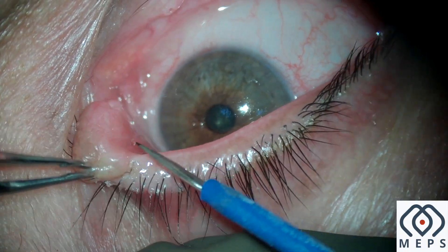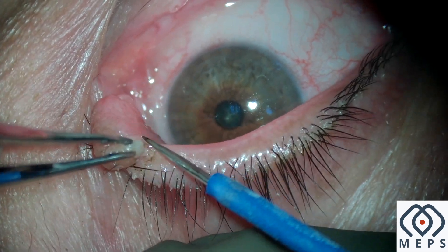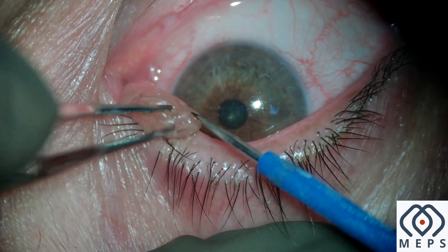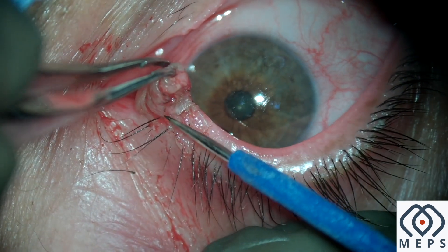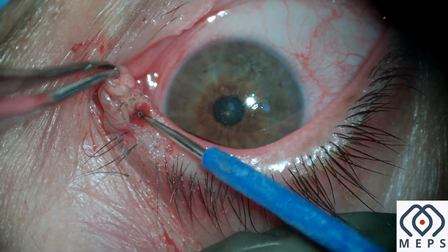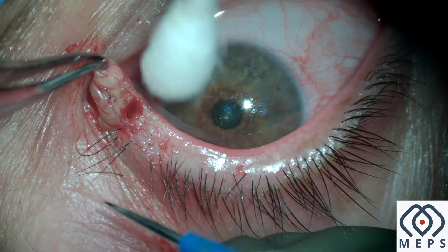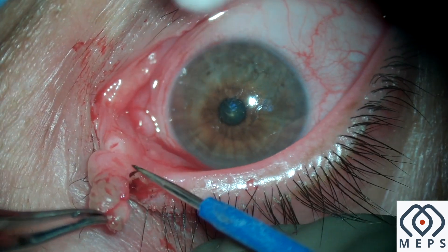Following this, a radio frequency tip is used to start shaving off the base of the lesion. You can see that the base comprises multiple vascular fronds which need to be coagulated for better visualization. This is where the radio frequency device aids in our surgery.